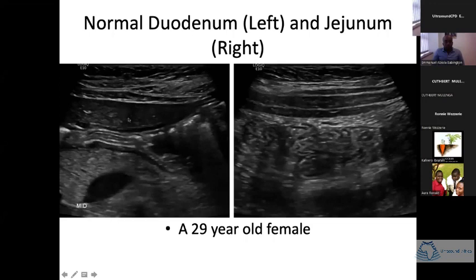There, you can see the left lobe of the liver here, and also the head here. So this image was taken right in the epigastrium, just there. And you can see the normal duodenum, you can see a gas pocket, the gas flowing to the anterior wall of the stomach and pylorus. And on the right side of this image, you can see the jejunum with more prominent bowel convolutions. Like I said, this is usually much better appreciated when the lumen of the bowel is centered.